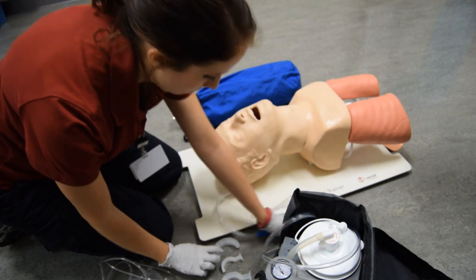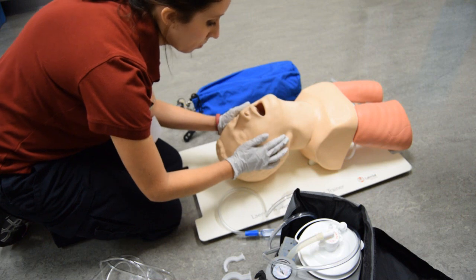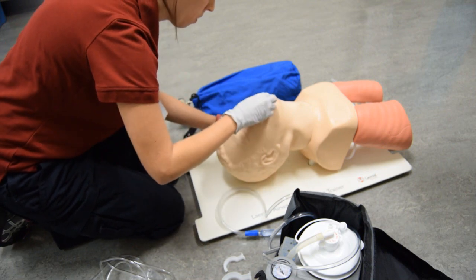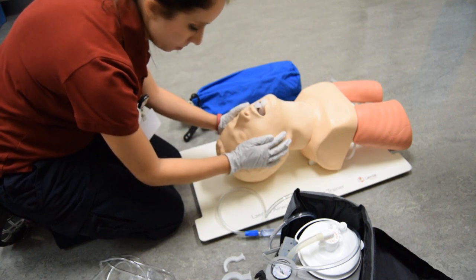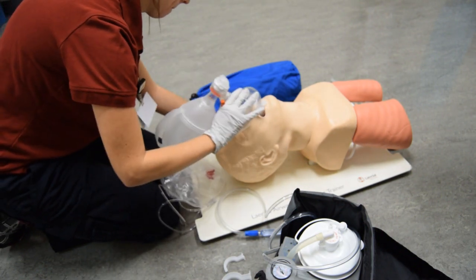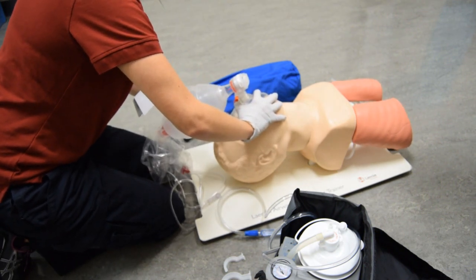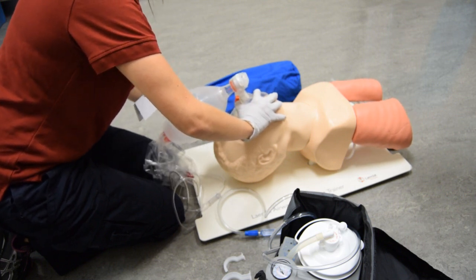The examiner now informs the candidate the mouth and oropharynx are clear. The student will now open the airway manually. Inserts oropharyngeal airway. No gag reflex is present and the patient accepts the airway adjunct. The student is to begin ventilations immediately using BVM device unattached to oxygen. The examiner informs the candidate that ventilations are being performed without difficulty.